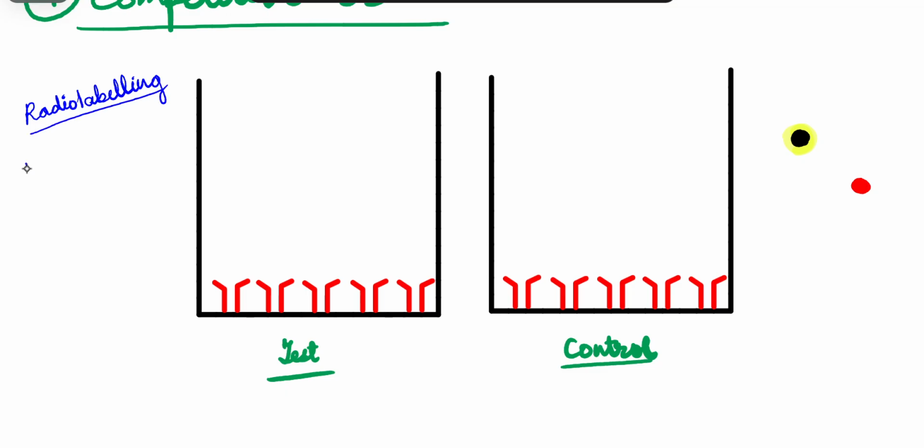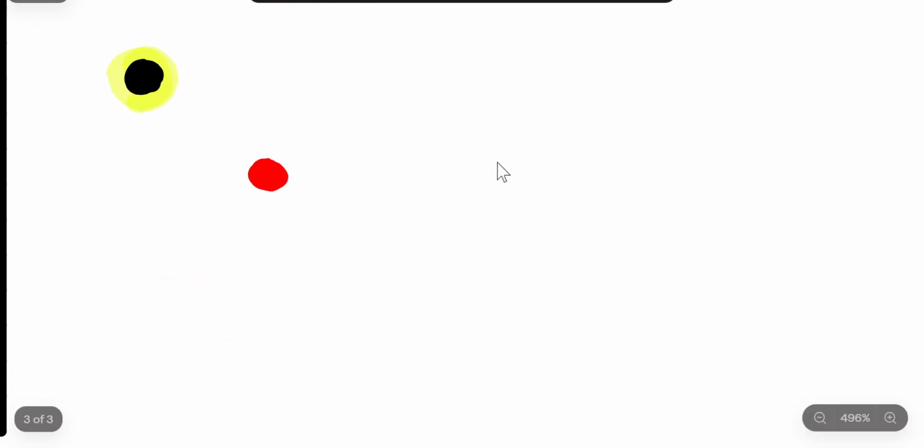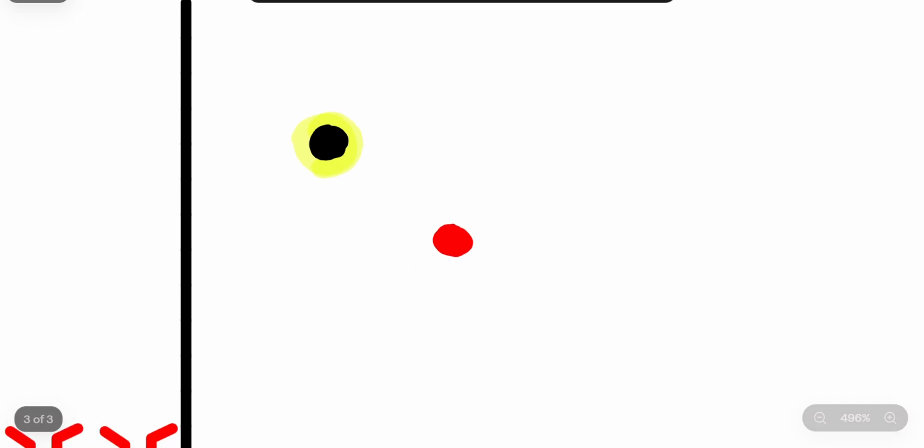See, again here we have to detect one thing, that is, we have to detect the antigen X in the serum. Again, the normal kind of ELISA only. So basically you look at the two antigens. The two antigens are very similar.